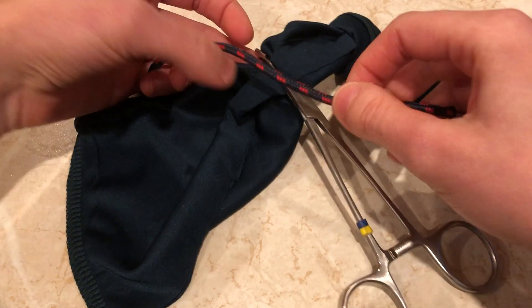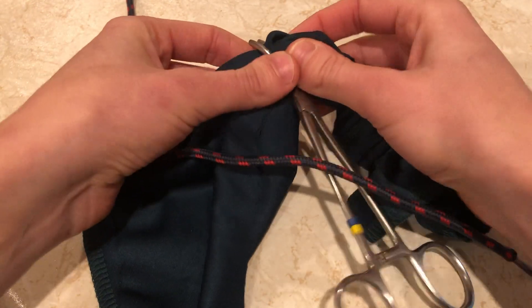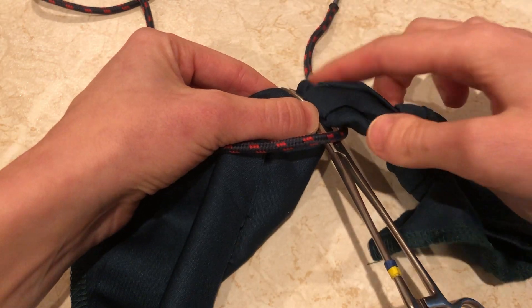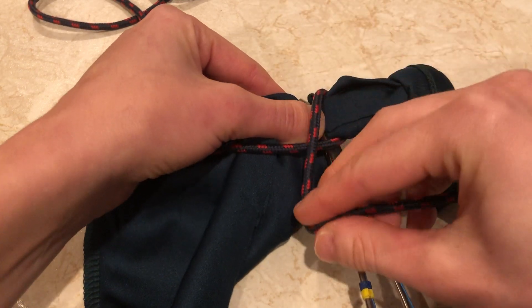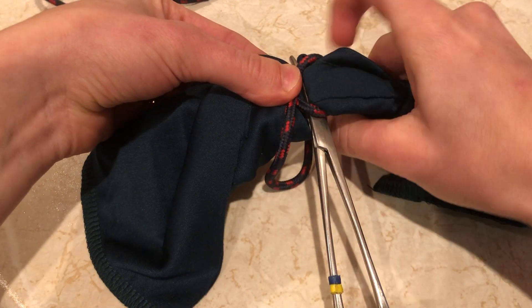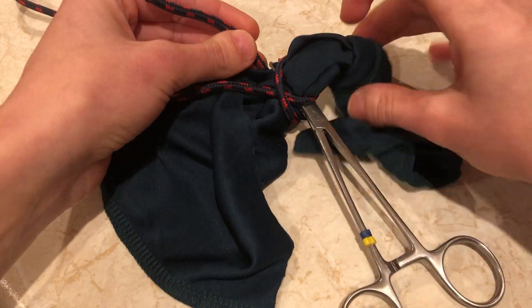I go diagonally across my haemostats like this to start with, and I always make sure the haemostats have the tips free — you'll see why that's useful in a second. That free end goes through the window we've created and out the other side on the ovary side of those haemostats. Then it crosses across and forms an X, and then it goes under the haemostats and right through the same fenestration that you've got.